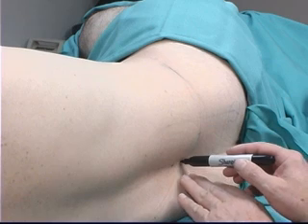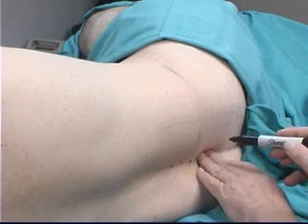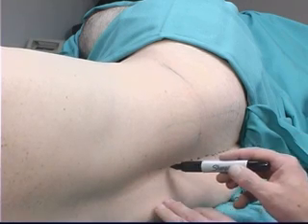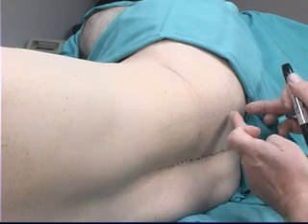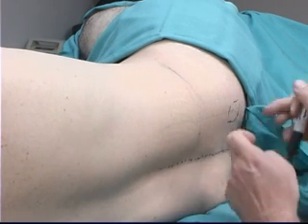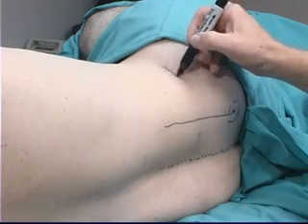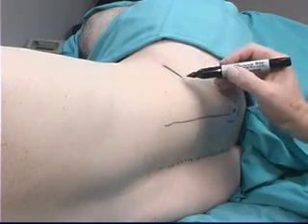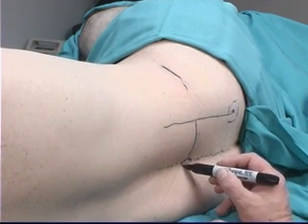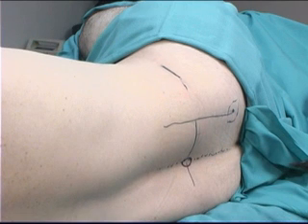With the patient in the lateral decubitus position and the lumbar spine flexed, a line is drawn marking the dorsal spines of the lumbar vertebrae in the midline. Palpate for the posterior superior iliac spine, mark it, and draw a line parallel to the midline from its midpoint. Palpate the iliac crests and draw the intercrestal line. The dorsal spine that is palpable on the line, which is marked here, is the dorsal spine of the fourth lumbar vertebra.